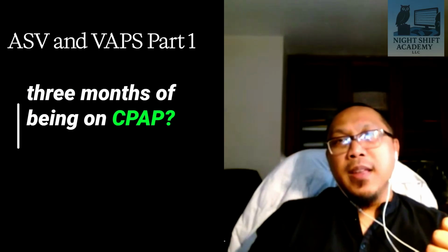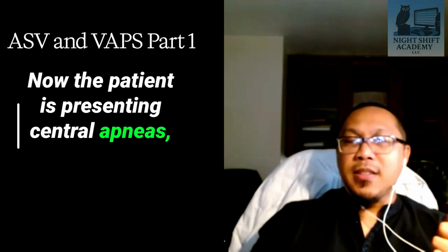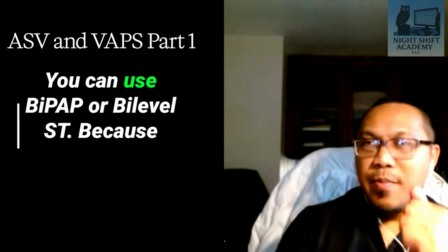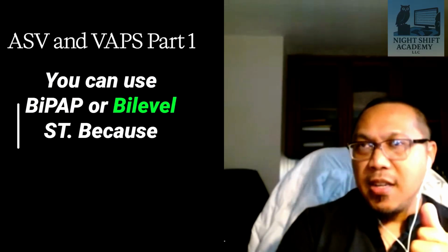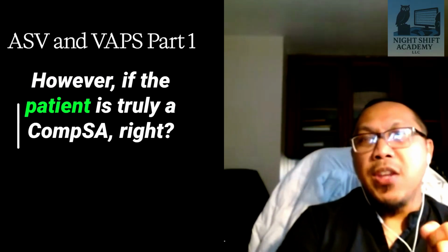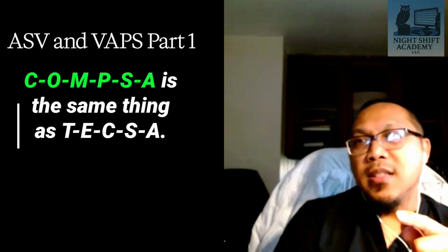After 2-3 months of being on CPAP, now the patient is presenting central apneas. What is the best mode for this patient? That's a loaded question, right? You can use BiPAP or bi-level ST, because ST is a backup rate. It will address central. However, if the patient is truly a COMPSA, right?